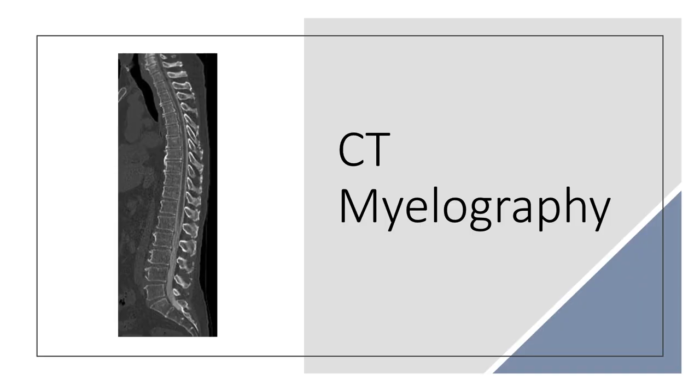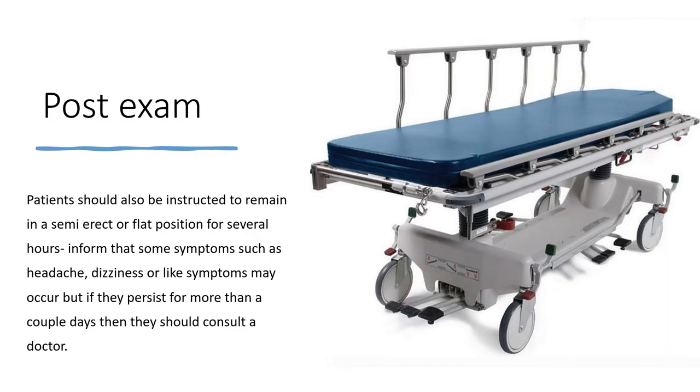After we are finished with our myelogram for regular diagnostic radiography, we will be sending the patient to CT for CT myelography. Post exam, you'll take the patient via stretcher. Patients should also be instructed to remain semi-erect or in a flat position for several hours. Inform them that symptoms such as a headache or dizziness may occur, but if they are really persistent for more than a couple days, they should consult a physician.